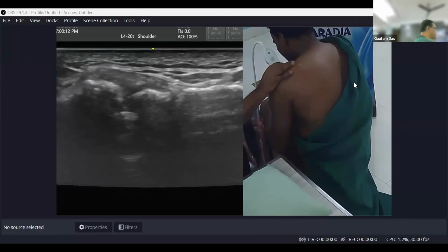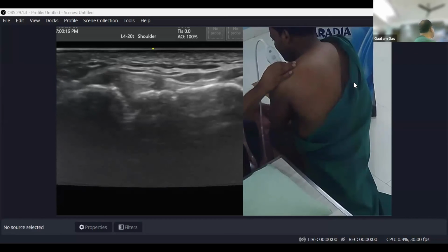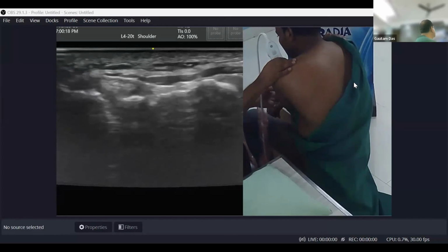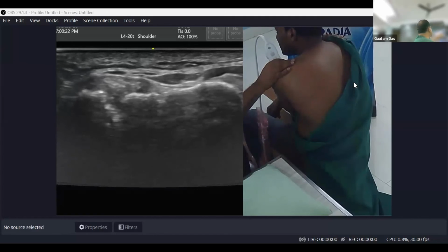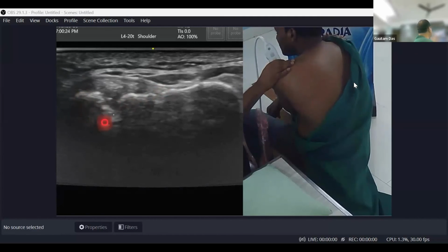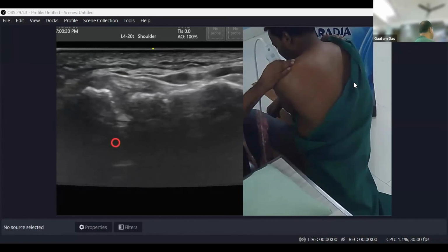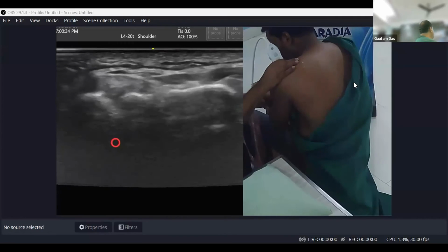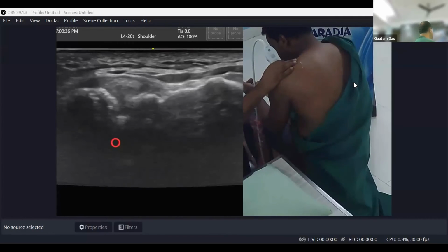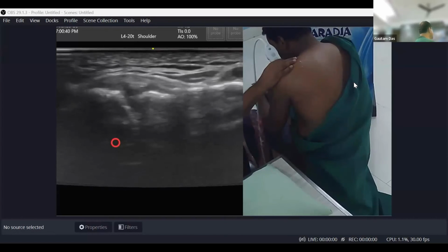Another thing, the scarf test, is to have the patient bring the arm across to that side and you see whether there is any subluxation. If there is, the joint part and the clavicle-acromion relationship will change. If it is grossly changed, that indicates dislocation or subluxation. Otherwise, osteoarthritis of the AC joint is very common. You'll see the irregular surface and the osteophytes there.